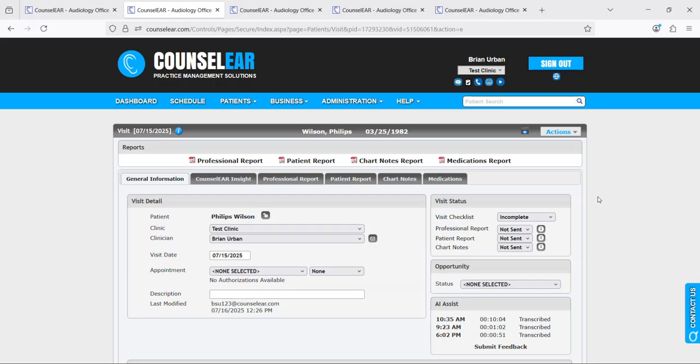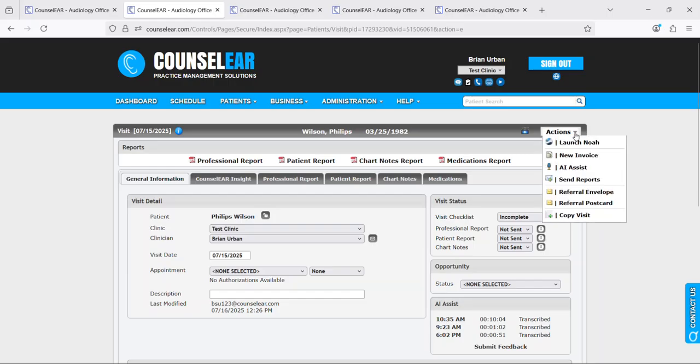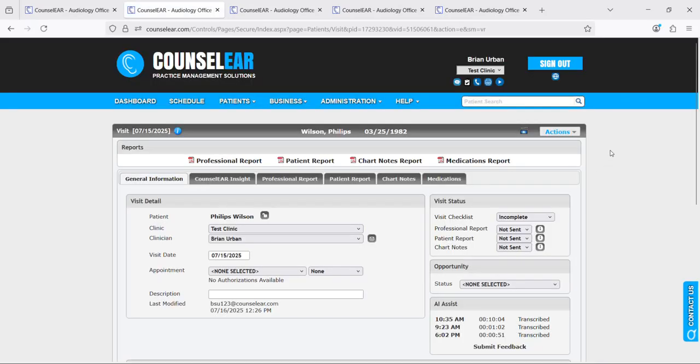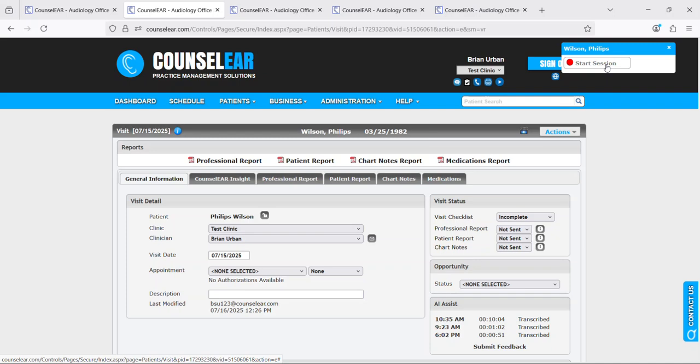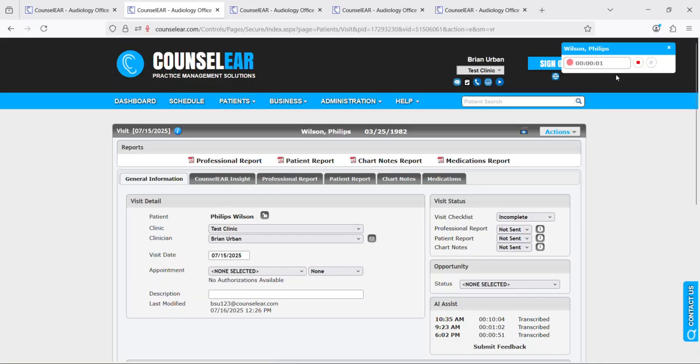In the patient visit screen to get this started, you would simply click on actions and then AI Assist. This is going to result in a pop-up allowing you to start the session. This is going to enable you to view a counter showing how long the session has been going on. It's going to give you the ability to pause and then of course end the session when you're ready. So I'll go ahead and just click start session here.